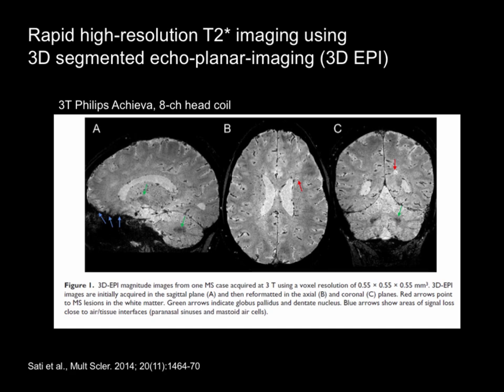John Batman at the clinical center suggested I try out a new sequence and play with it on the scanner. So I spent a few weekends, actually a lot of weekends, testing, optimizing, and refining the protocol until I reached this 5-minute scan that allows you to do 0.5 isotropic. So this is 500 micron isotropic on a 3T scanner of the whole brain.